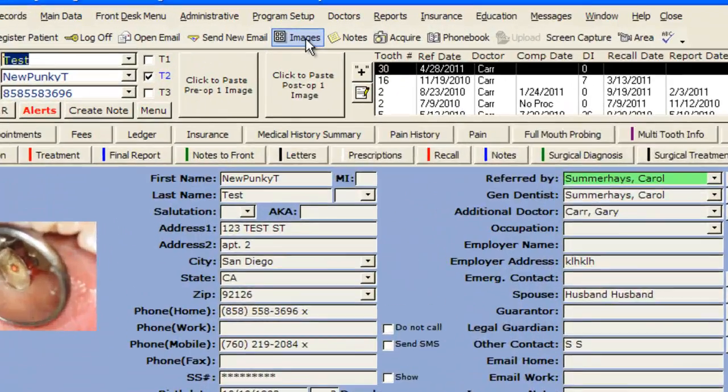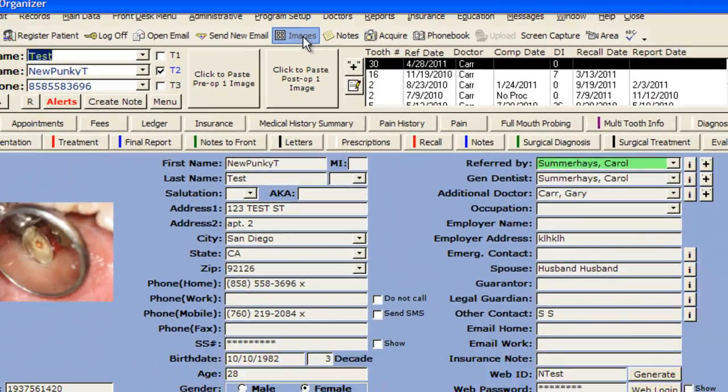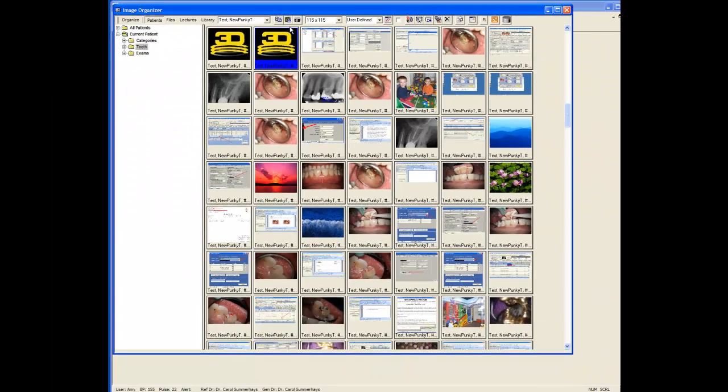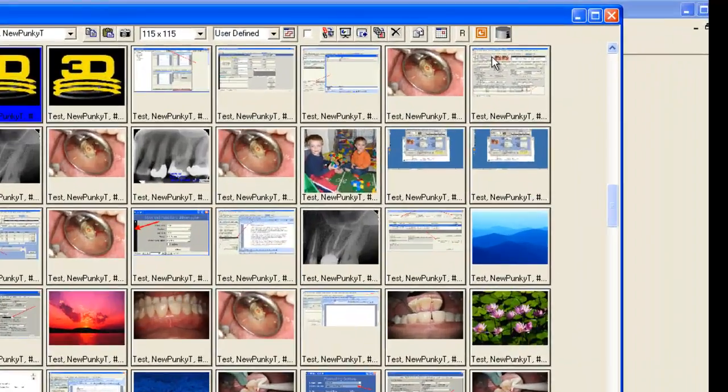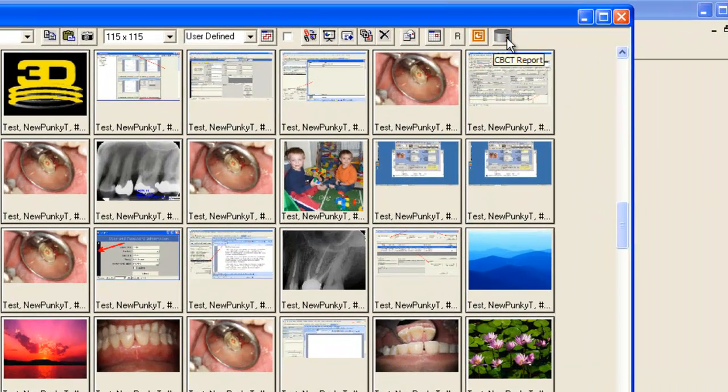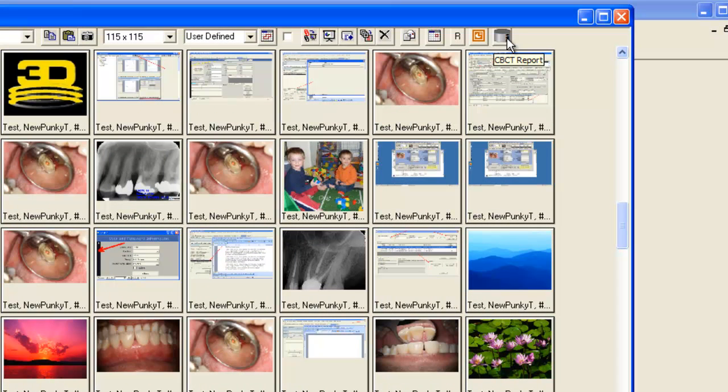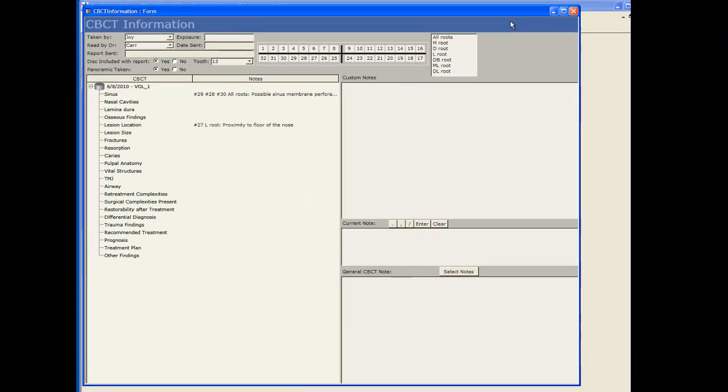Click your images button to bring up your image organizer, select one of the 3D images and then click the button on the upper right hand corner that says CBCT report and it looks like a cylinder.